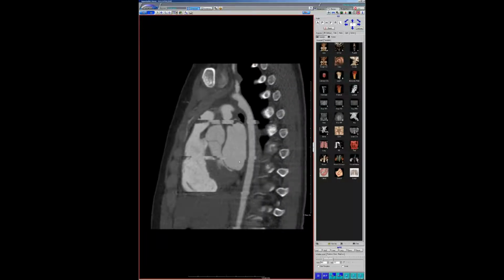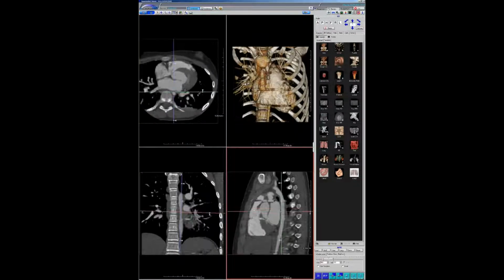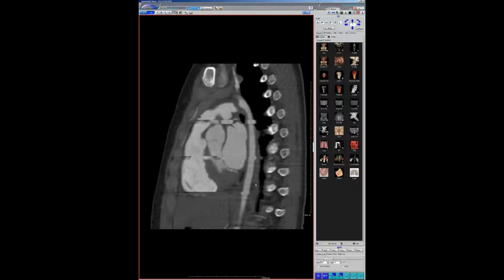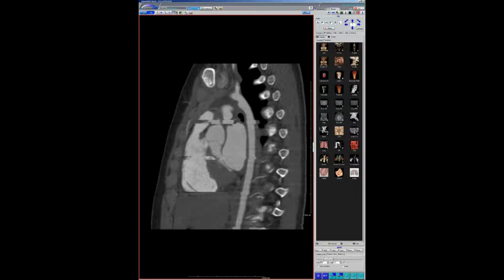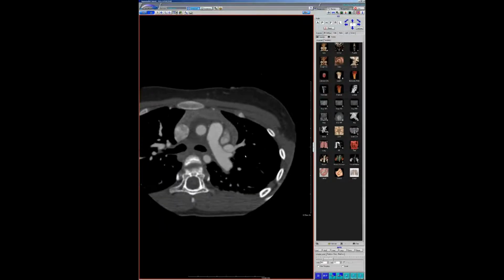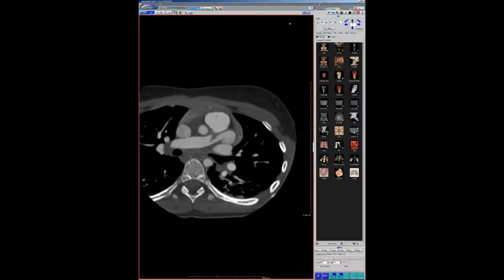And I have one kid I showed a long time ago, probably about 7 years ago now, I don't even know, that was a newborn that we did a study on, whose whole aorta was like a millimeter or two. It was just the smallest little thing. But yeah, it can be both diffuse or focal, and that's true for the PAs as well. And the PAs are usually quite affected, so I'm surprised this one is relatively normal-ish.